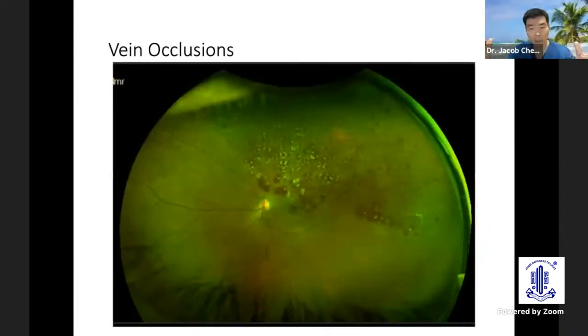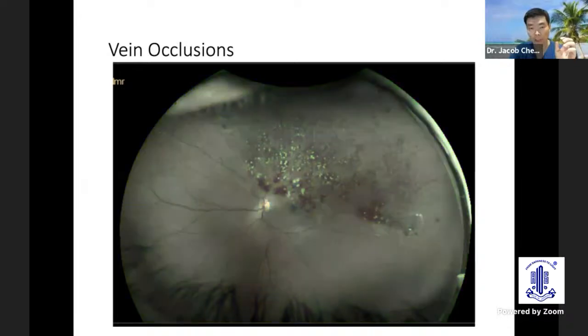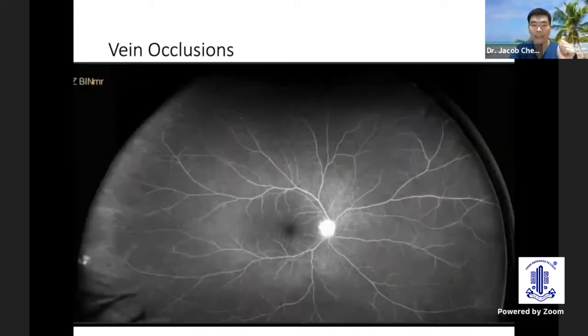Good ultra-wide field photograph to document the slow resolution of the hemorrhages with the application of sectorial laser, again helped by the green laser.